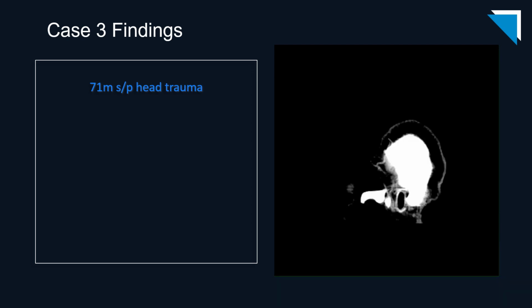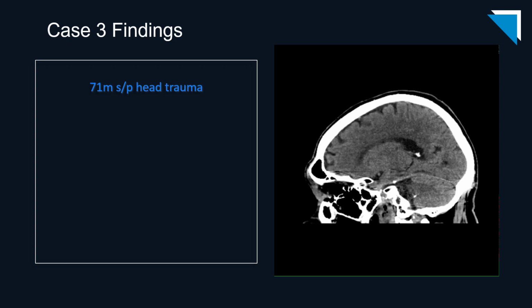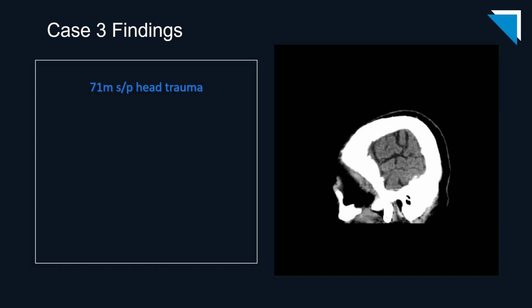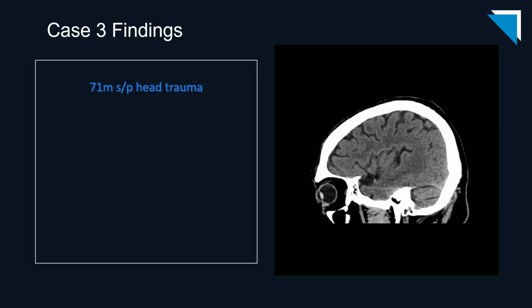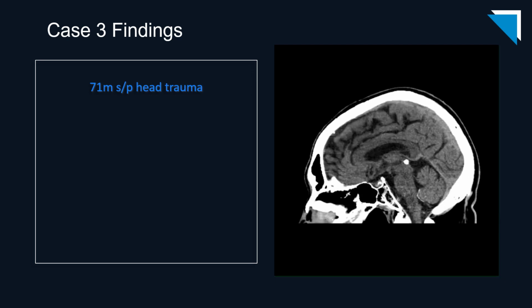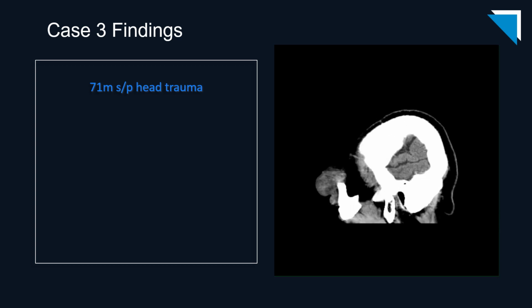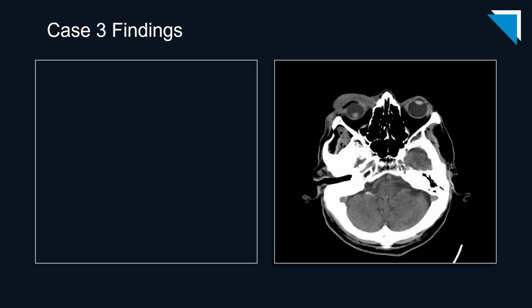Here are the sagittal images from the same patient, and again, my eye is drawn to that right orbit. I want to be careful never to abandon my search pattern when I see an important finding that bears more scrutiny. Of course, if I omit something from my search pattern, there is almost nothing I can do to avoid a miss other than relying on luck.